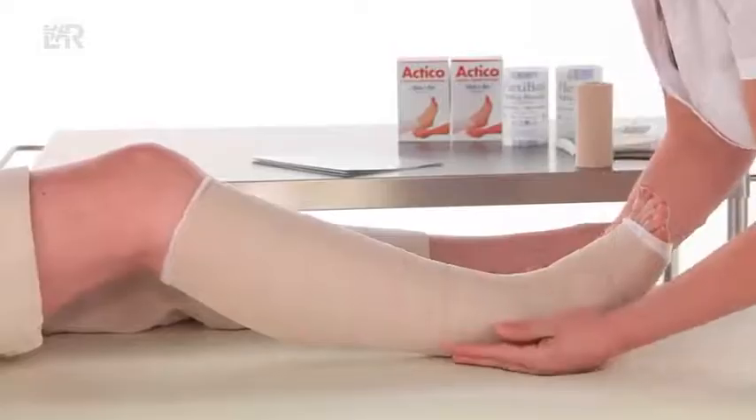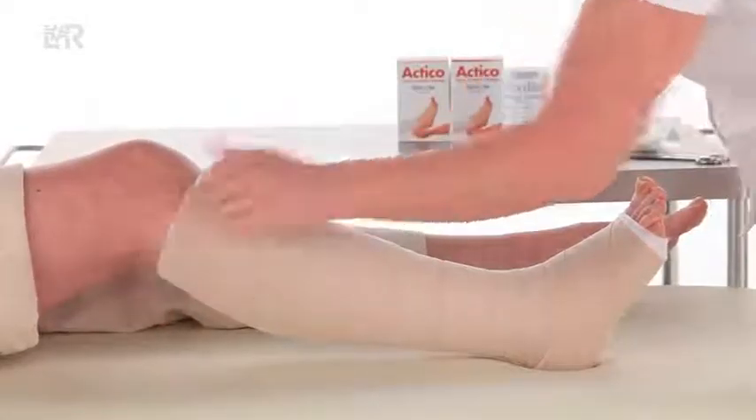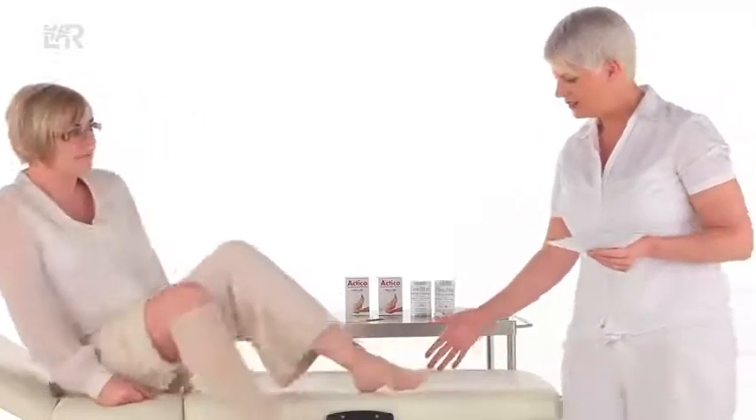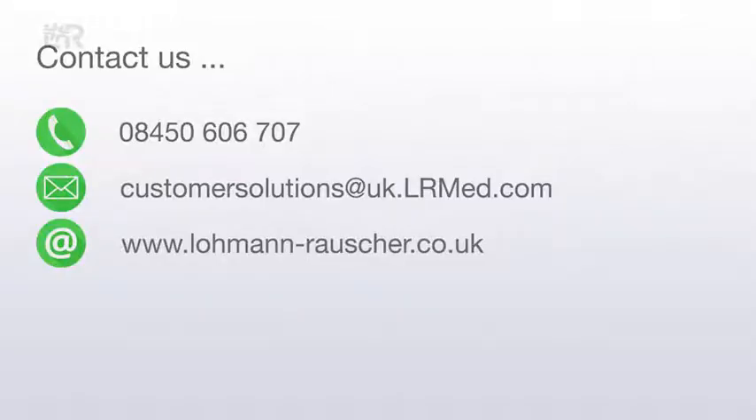Actico is capable of maintaining pressure without slippage due to the cohesive nature of the bandage. As with all compression bandage systems, training on the correct application is recommended. If you require any further information before applying the Actico cohesive inelastic compression system, then please contact our customer care line.